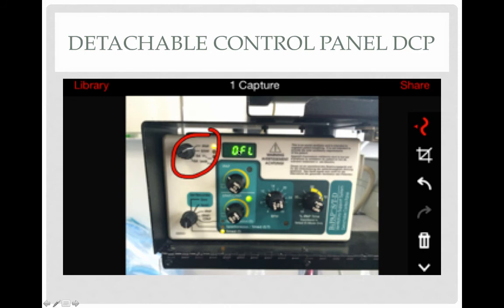So as we move this control around, it can either display the IPAP pressure, the EPAP pressure, the tidal volume, or the leak. So we can just display one thing at a time. Down here is our mode selection. Then up here is the IPAP control. In the preceding slides, I'm going to go through each of these controls, but I wanted to give you a brief overview first.